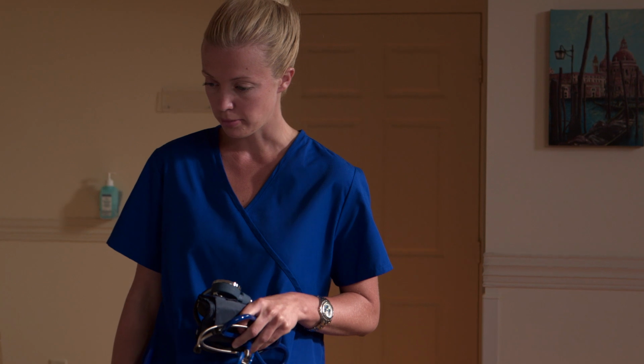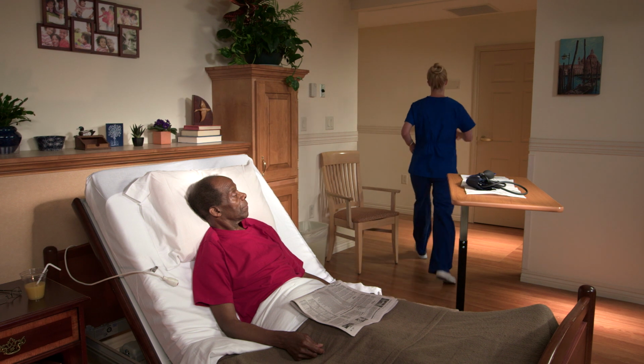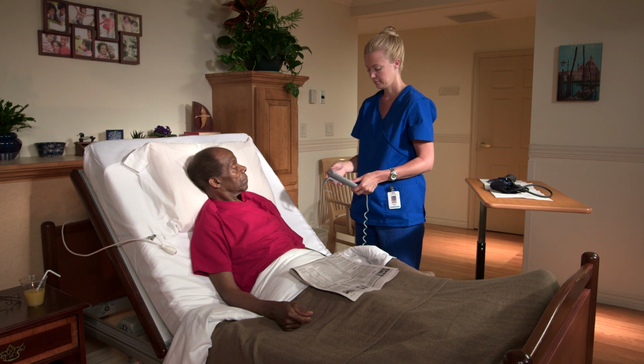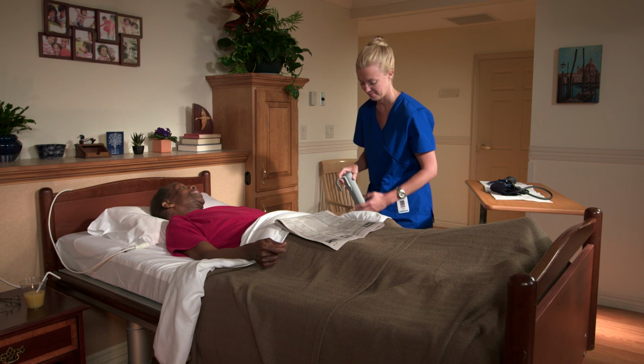I'm going to check the measurement on your blood pressure. Is that okay? That's fine. All right. Adjust equipment as needed for body mechanics and safety. How's that, okay? That's great.